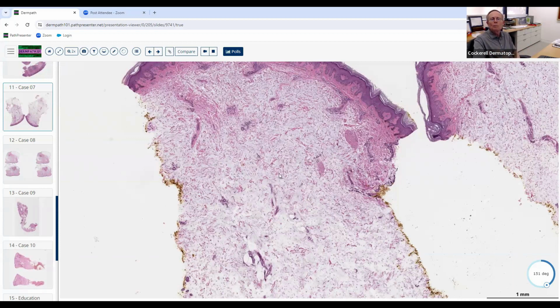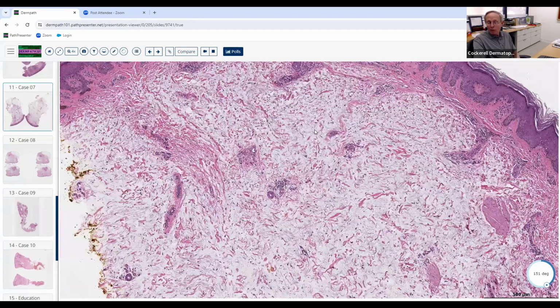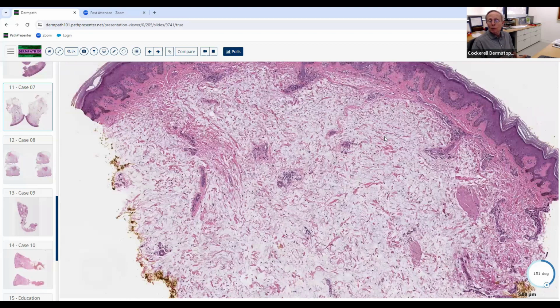So this is pretibial myxedema. Now, the other thing you have to think about are neoplasms, where you can get lots of mucin. So, for example, a myxoid lipoma, sometimes you can see lots of mucin there. Usually you can see that there are fat cells in there also, and you'll get some spindle cells. So that'd be a little bit of an unusual situation there.